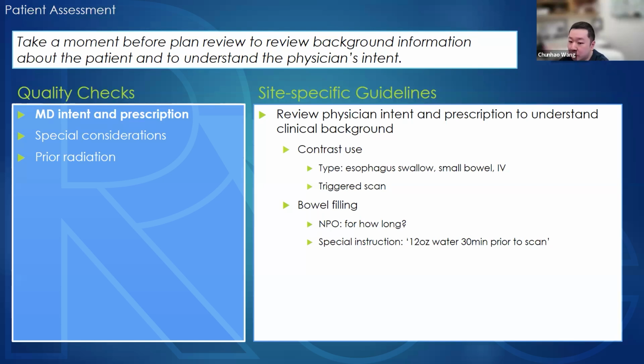So sometimes we use a dynamic contrast protocol, which we also call the trigger scan. In trigger scan, we want to visualize tumor or the GI luminal structures with different contrast dynamic phases per timing. So usually we inject the contrast and, based on the fixed protocol, like how long from the injection of the contrast, we're going to acquire multiple scans. Of course, based on the contrast dynamics, they're going to show different image contrast. And by comparing different images, we should be able to provide a better visualization of the target.